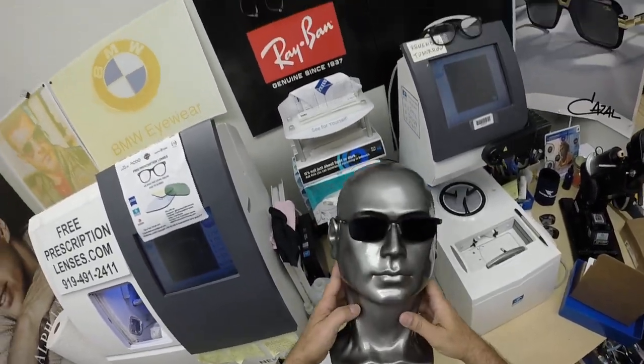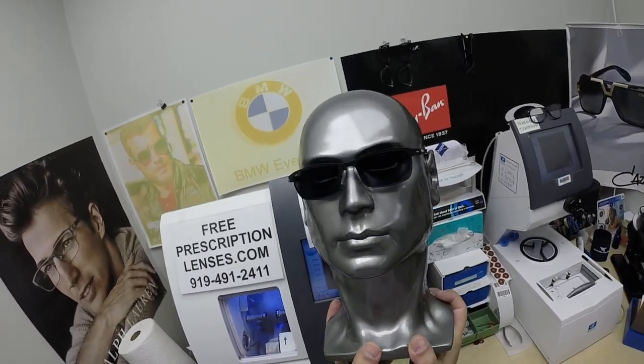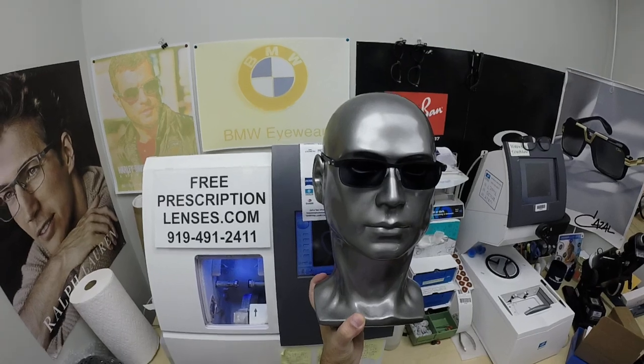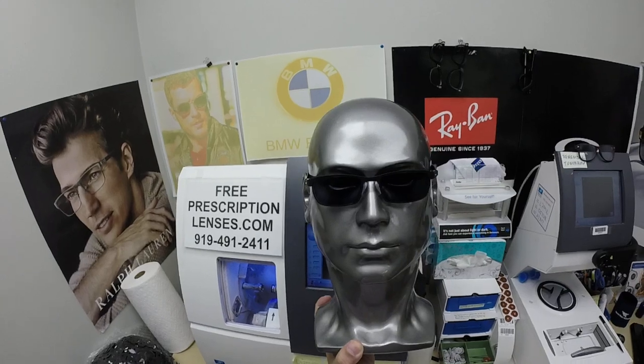The only time they won't work perfectly is if you're behind the windshield of a car. Your windshield absorbs the sun's harmful ultraviolet rays — the same rays that would cause your dashboard to crack from sitting in the sun all day — and that's why they don't turn dark in a car. Having said that, these Zeiss Photo Fusion Extra Gray will get up to 50% dark behind a windshield.